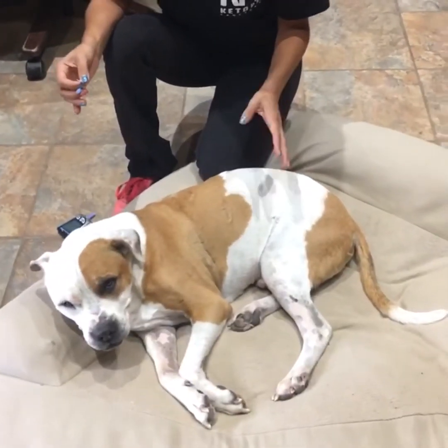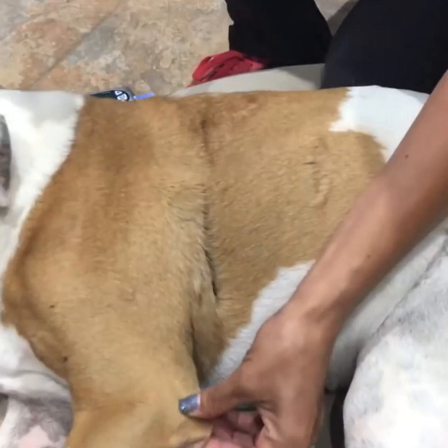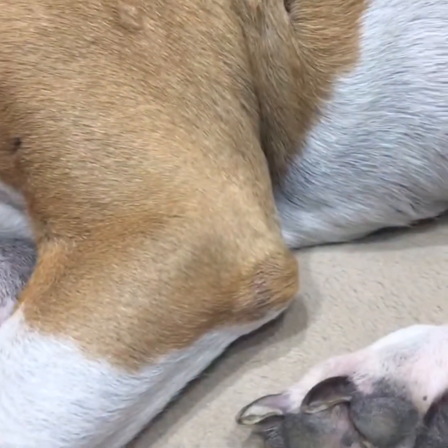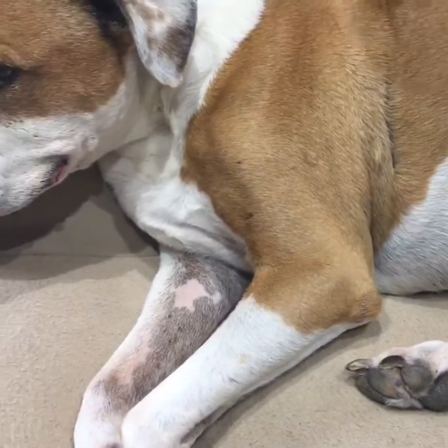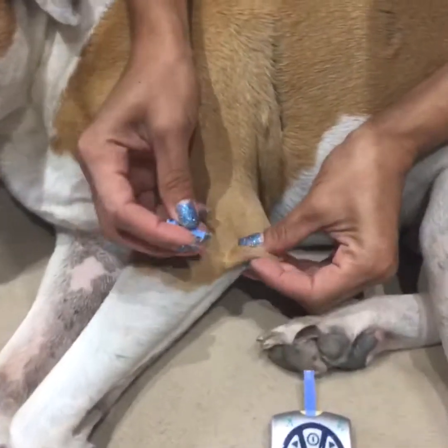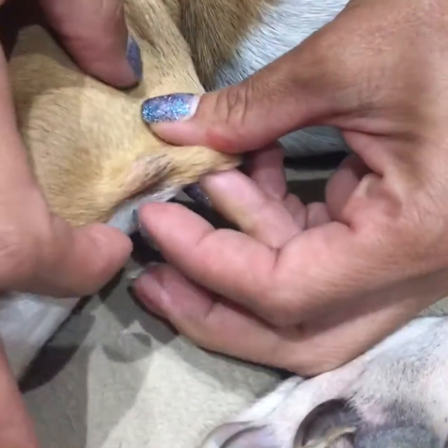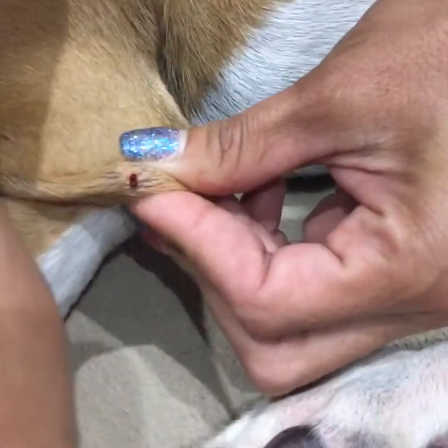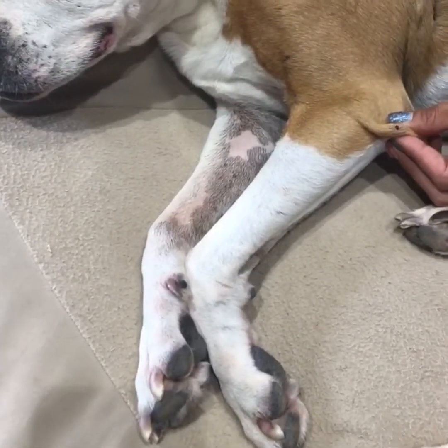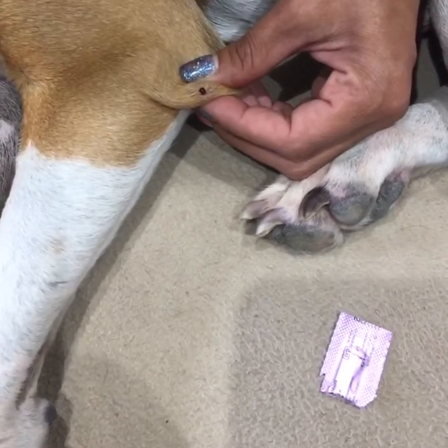A lot of the big dogs, especially the older ones, tend to have hair loss on the back of their elbows. Just like our own elbows — if you pinch your elbow you don't feel much. So they don't tend to feel much there either. With my glucose strip ready, you just pick an area on the elbow callus, squeeze it together, poke it — he didn't even notice — then squeeze and you've got plenty of blood. His reading is 59.